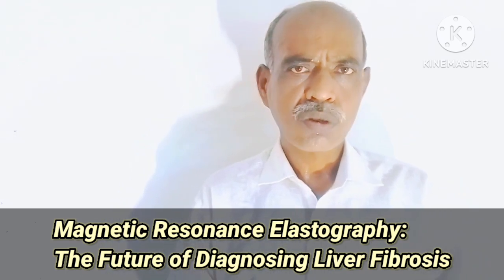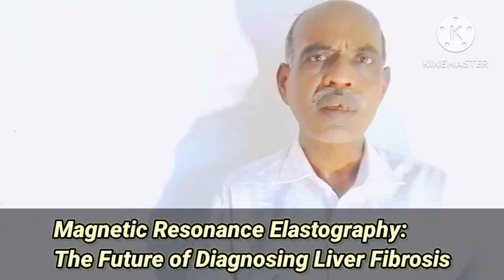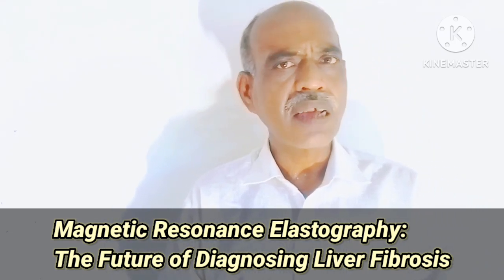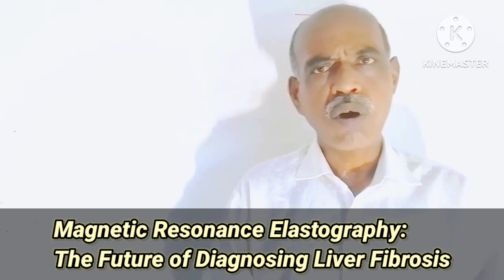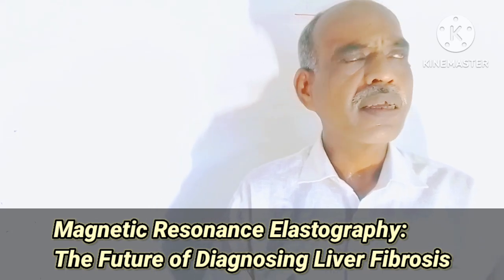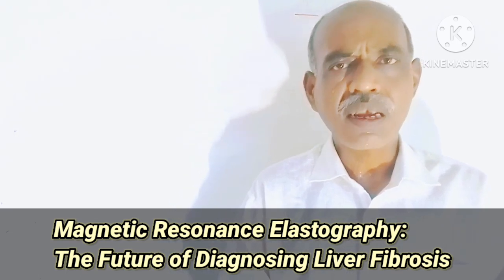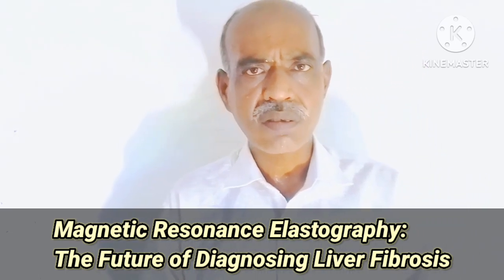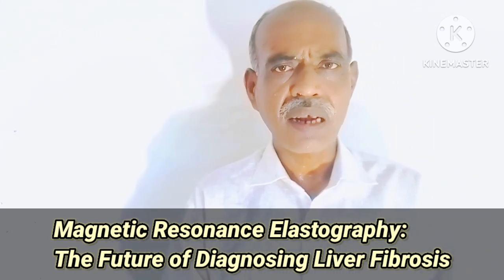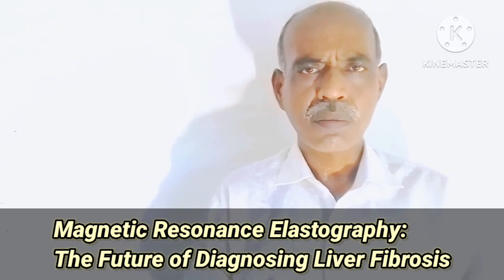Okay, so this was all about it. In case of MRE, what is done actually? The patient lies down inside the MRI scanner. Strong magnetic fields are used. Then radio frequency pulses are used. And a vibrating pad. First of all, a vibrating pad is placed on the abdomen of the patient. And that vibrating pad produces low frequency sound waves. And then MRI acts according to the technique of MRI. So that way this process is done.